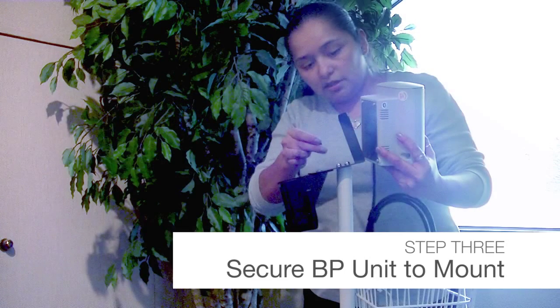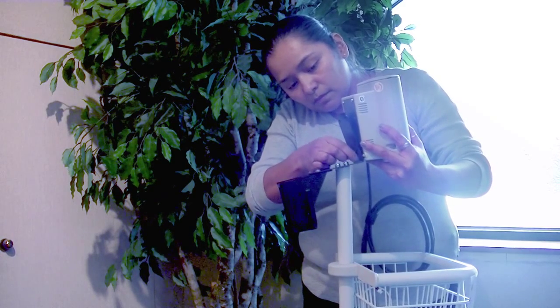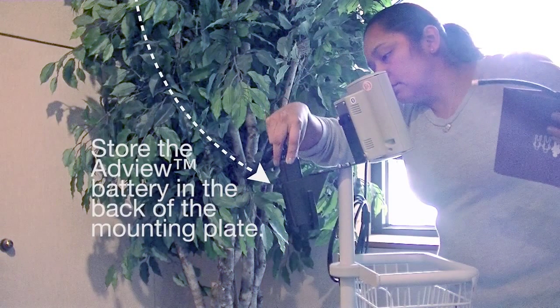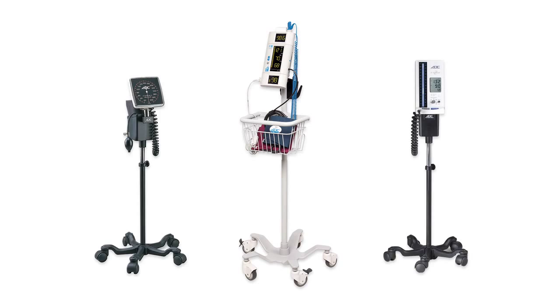Once the stand is fully assembled, you can attach your manometer. Align the holes on the mounting plate above the basket and hand tighten the three included mounting screws. Ensure that this connection is tight to avoid damaging your manometer. Attach the inflation system to your manometer and store the cuff and bulb in the attached basket.